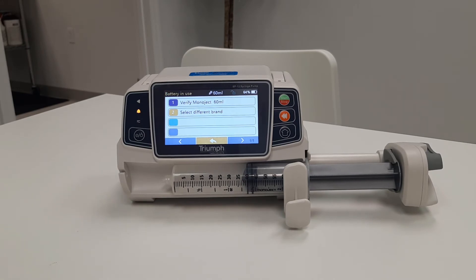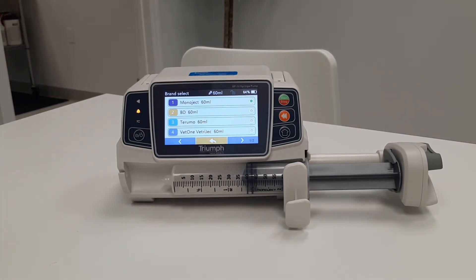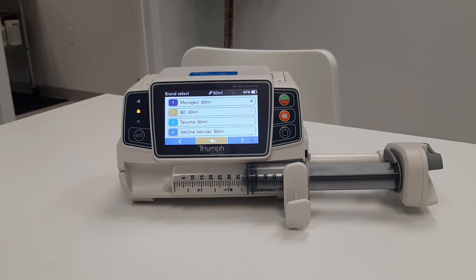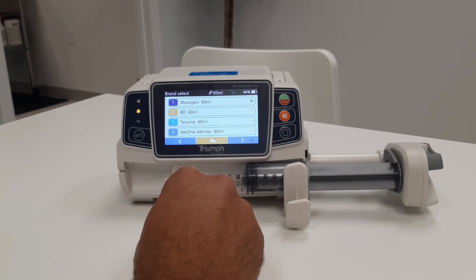Now the pump will ask you to verify the syringe manufacturer and size. The pump will automatically default to the last brand used. If a different brand is being used, simply select different brand. Notice at the bottom of the screen there are arrows and a page reference. To scroll through the brands, simply select next page, previous page, or back to go to the previous screen.